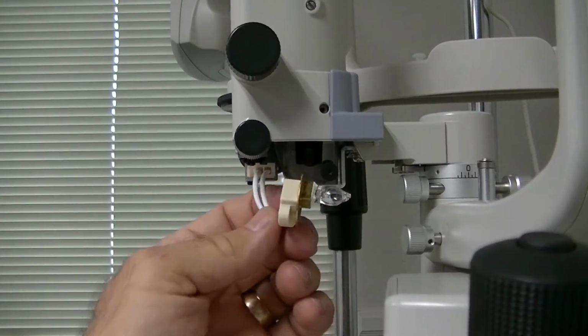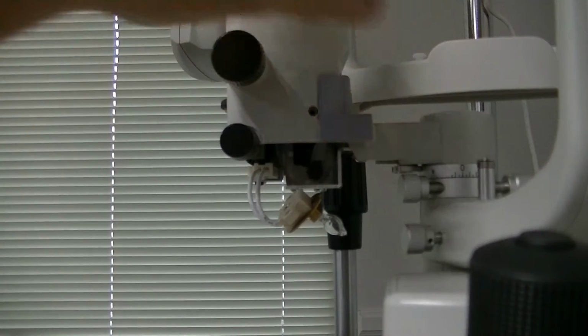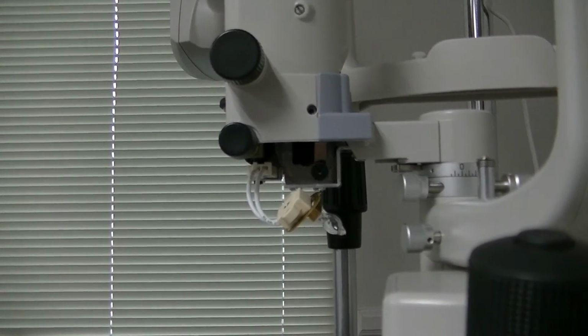Now putting it back in is not that easy either. As you can see the hole in there. Let me see if I can zoom in a little bit more.